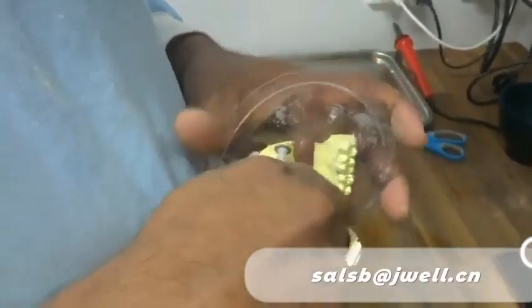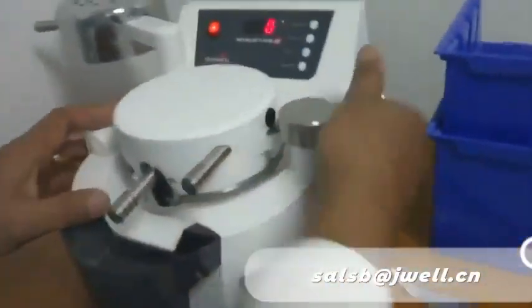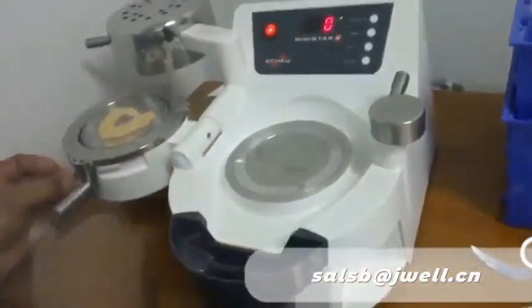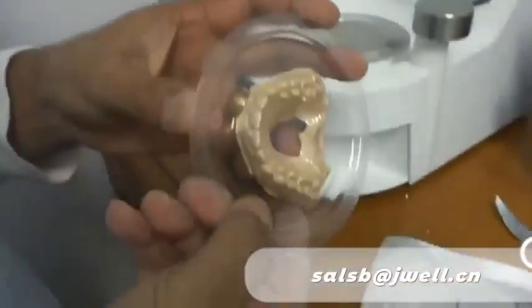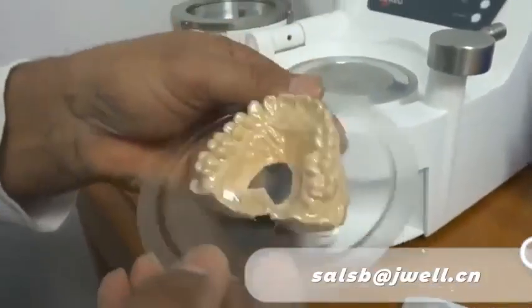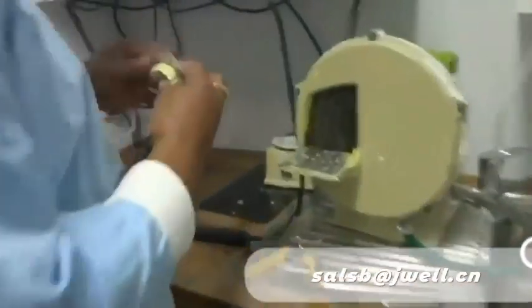Okay, that thing has now finished its cooling cycle, because I heard a beeping. I'll take you over there and I'll show you what it looks like. Finish the cooling cycle, so it's pretty simple. You just open it up like that, and there we have a nice suck down. These pressure forming machines are really good. So we'll just finish off with this one here.